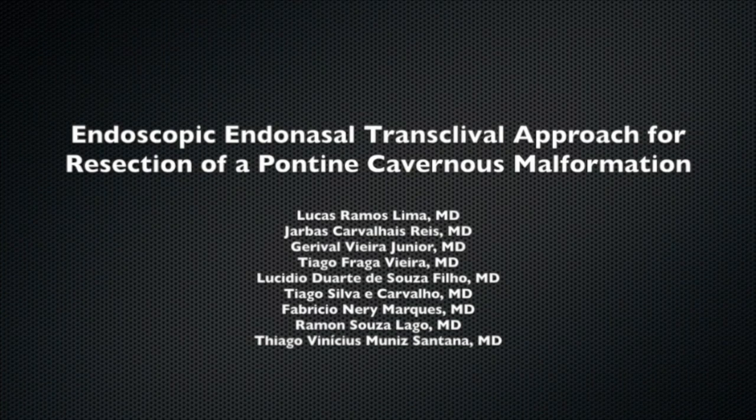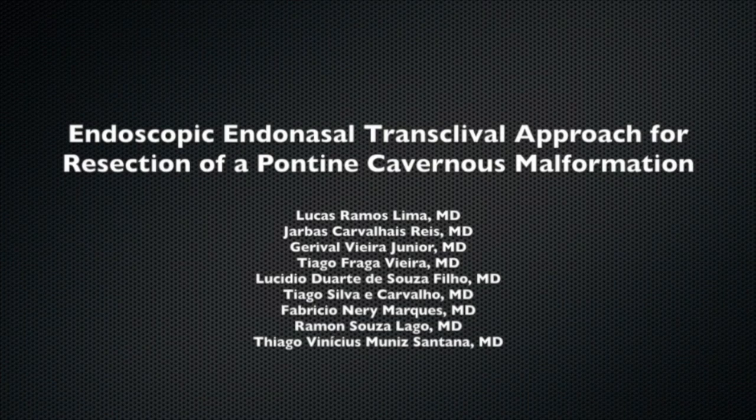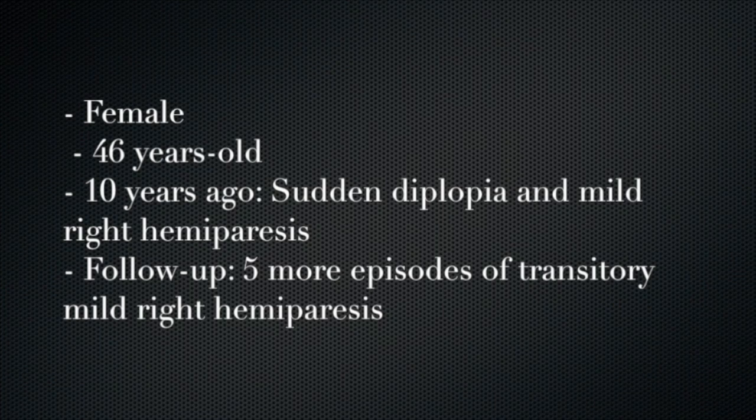This video demonstrates a complete resection of a pontine cavernous malformation through an endoscopic endonasal transclival approach. A 46-year-old lady presented sudden diplopia and right hemiparesis 10 years ago with complete neurological recovery, followed by 5 more episodes of mild right hemiparesis. The last episode occurred 6 months before the surgical procedure.